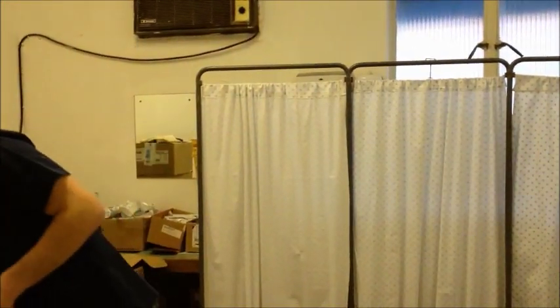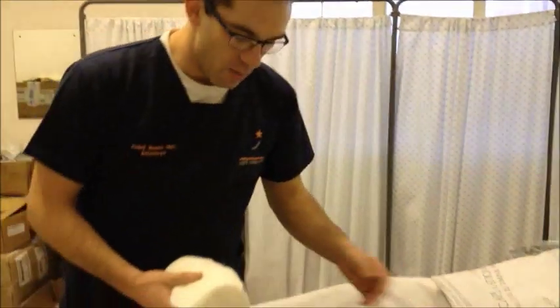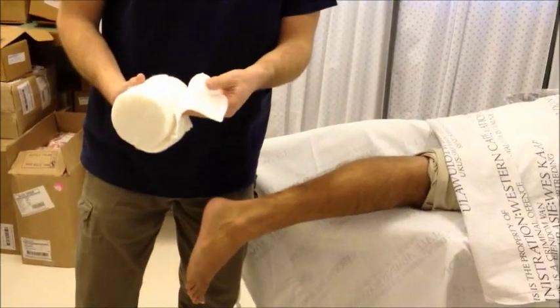We'll start off with a layer against the skin. Obviously the plaster can't be applied straight to the skin. The two ways you could do it is either with stockinette, which is expensive — we're not going to do that here today because we're in a resource limited environment. What we'll use is skin wool. You can use whatever your hospital has, and because it's going to be the lower limb, a nice broad band of skin wool.